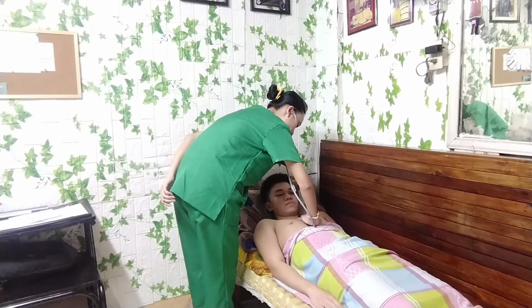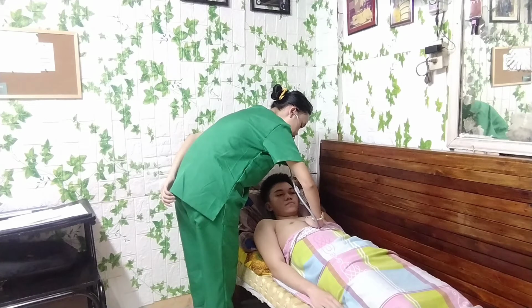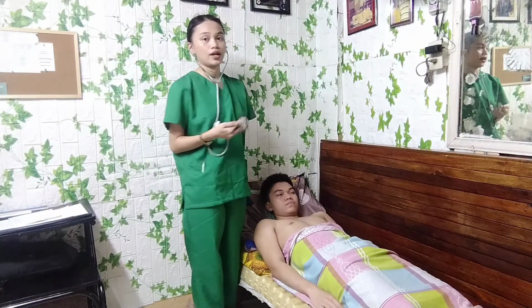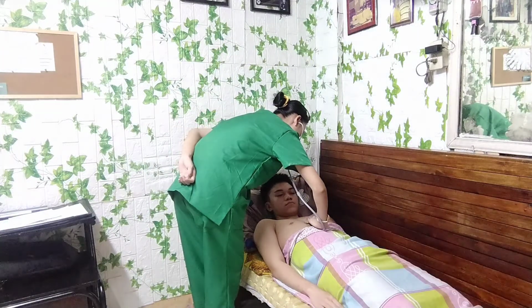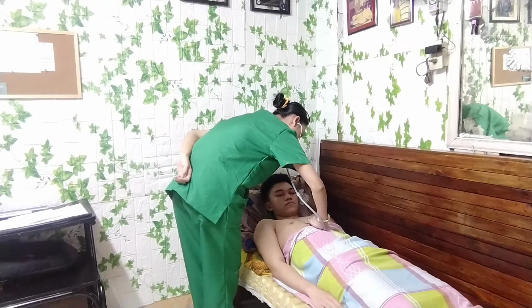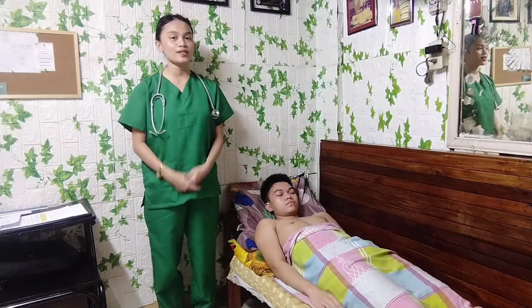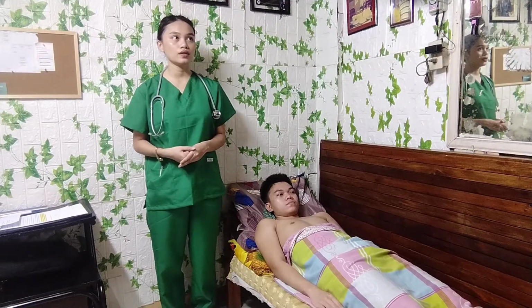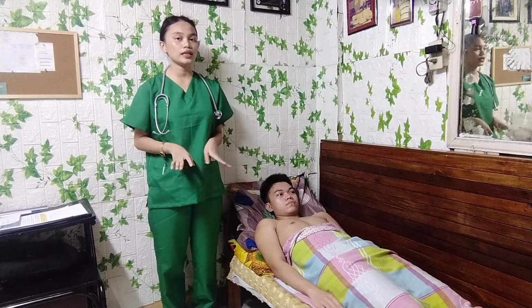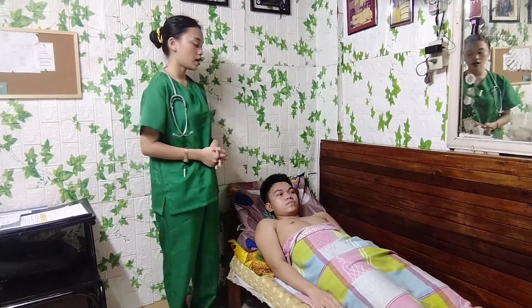Okay, down to Erb's point. To the mitral area. And last one, the apical area, which is found at the fifth intercostal space at the mid-clavicular line. So sir, upon auscultation of your landmarks, your S1 and S2 are distinct in all areas and are a normal finding, and I don't observe any signs of splitting sounds of the heart, and no murmurs or thrills heard, as well as S3 and S4. Overall, they are in a normal finding.